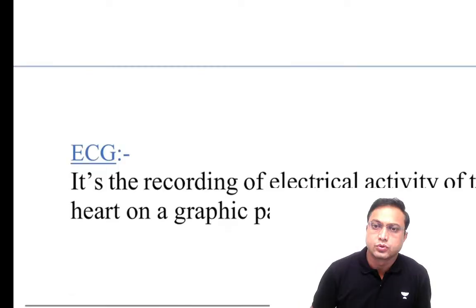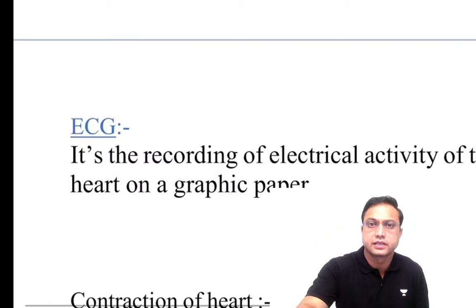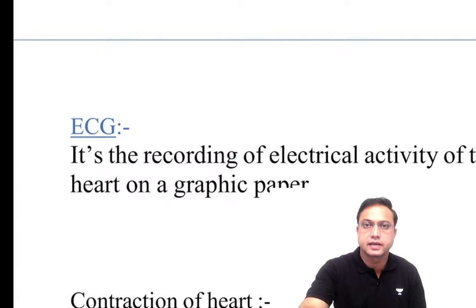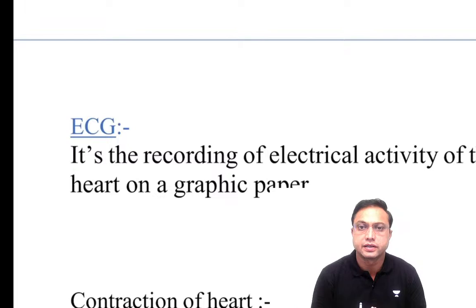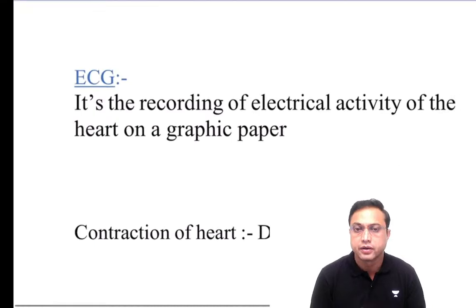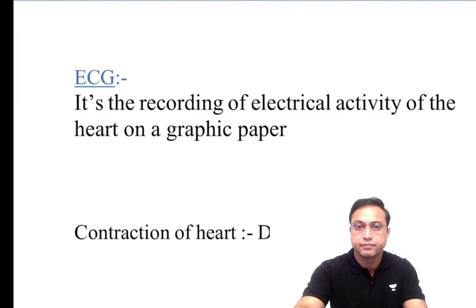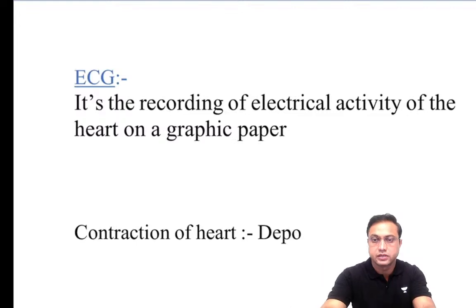So guys, let's restart this class from the start. We know what this ECG means. This ECG means basically, my dear friend, that this is the electrical representation, as written on this paper, that it is the recording of the electrical activity of the heart on a graphic paper, right? So that is the definition of the ECG. I really apologize for the delay due to these technical issues.